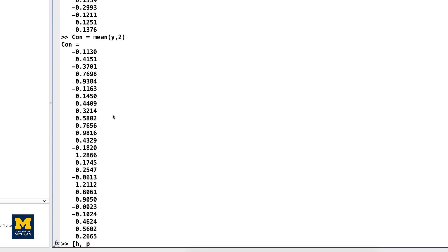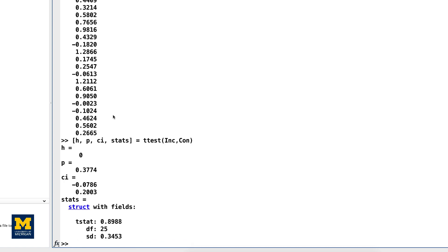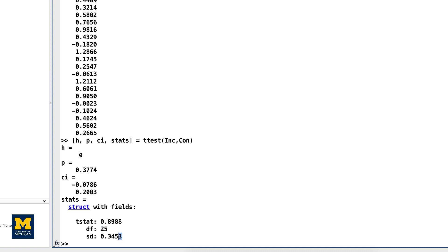We can enter this pair into a paired samples t-test using the following code. This will return four variables representing different parts of the hypothesis test: H is the result significant (0 equals no, 1 equals yes), P is the p-value for the hypothesis, CI is the confidence interval, and STATS displays additional statistics including the t-statistic, degrees of freedom, and the standard deviation.